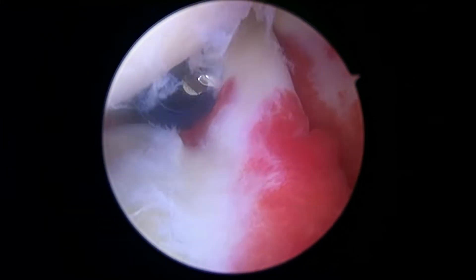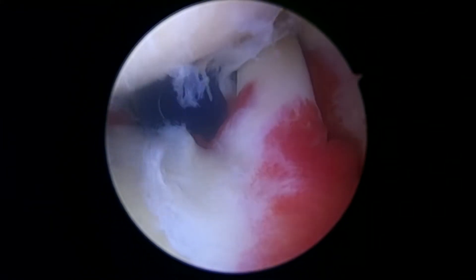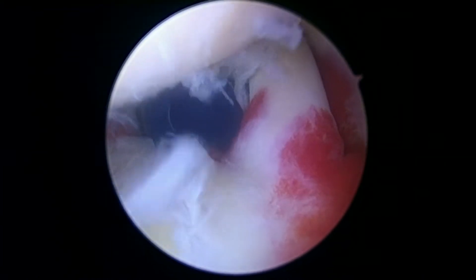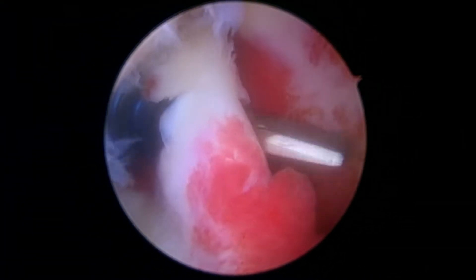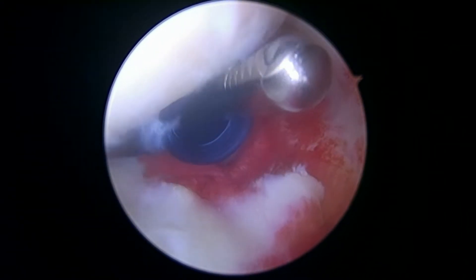Our plan, I think, is a good one because it worked so well on the other side also. So we're going to go ahead here with a pair of scissors and release the biceps. And then we'll go ahead and use our shaver to smooth out the rest of the labrum that's a little bit torn here. Just that quickly, we're able to release the biceps.